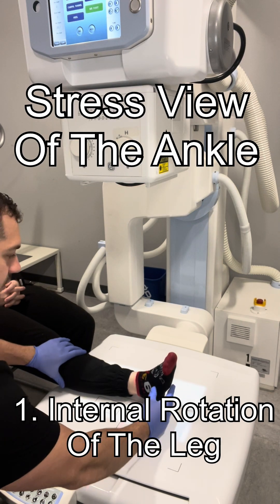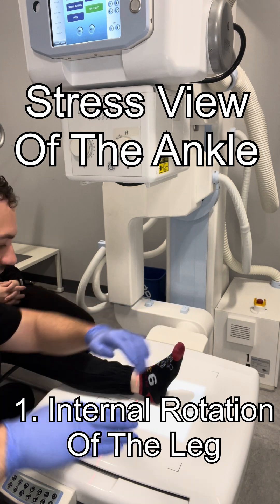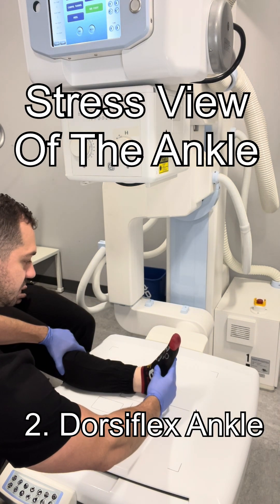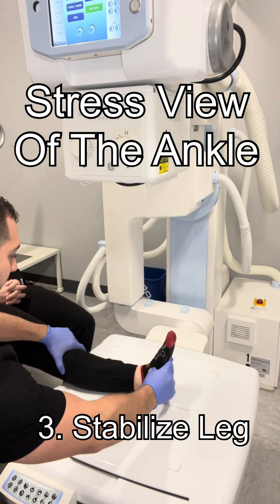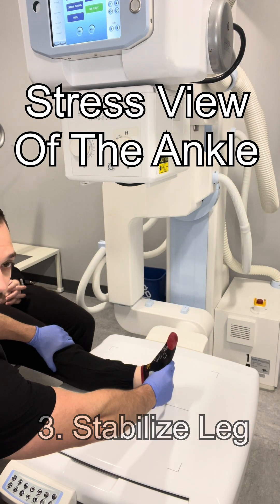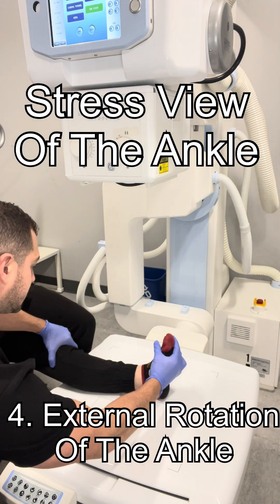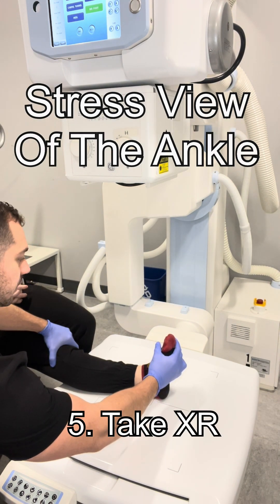So the first thing we have to do is slightly internally rotate that leg so the tibia and fibula are in about the same plane as the board. The next step is to go ahead and dorsiflex that foot and ankle, bring it up towards their face. From this position, we have to make sure we stabilize that leg just a little bit up top, usually a couple inches below the knee. The last and final step is to externally rotate the patient's foot. From this position, we'll go ahead and shoot our x-ray and take a look at what we got.